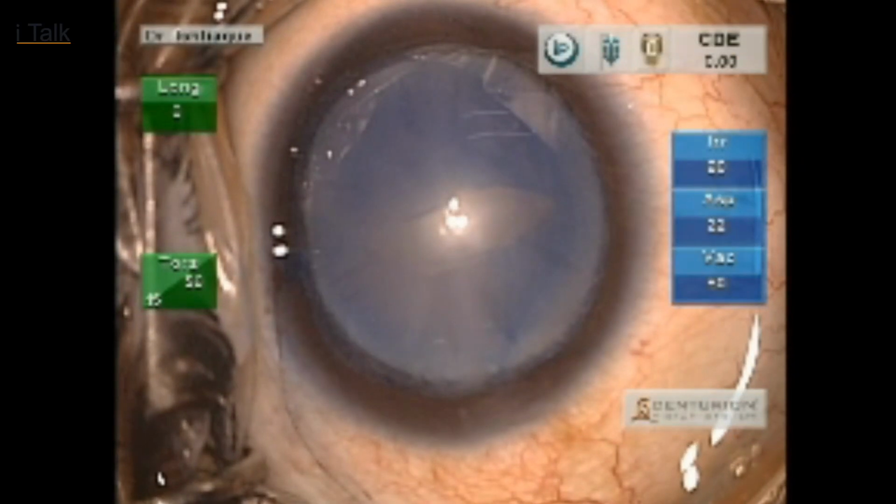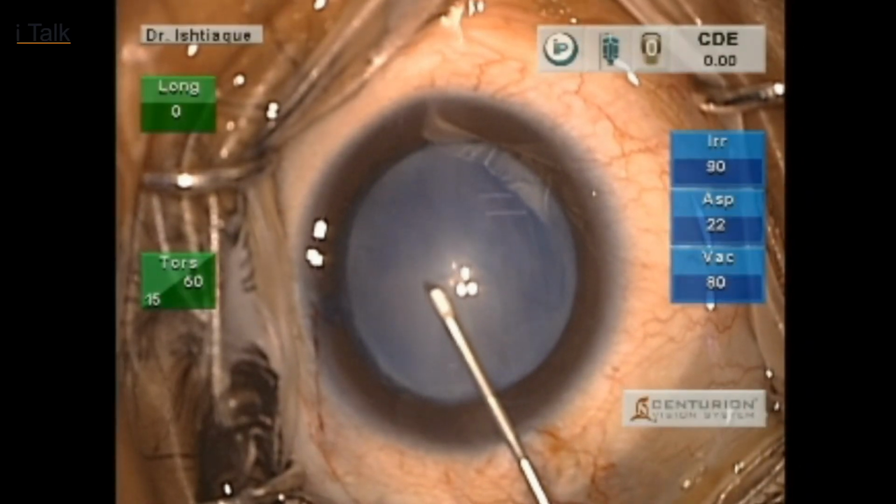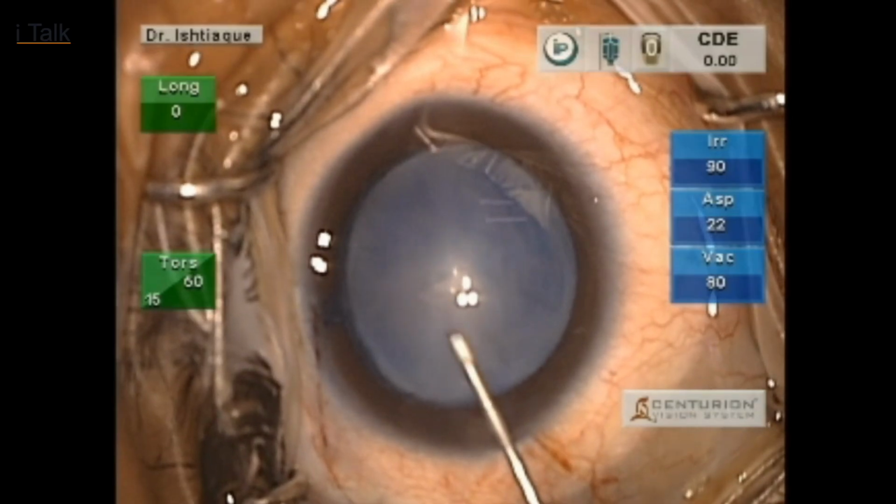This Argentinian flag sign is something which all of us make efforts to prevent. And there are a few things which, when you look back, you would have realized could have been altered. When you retrospect, you would have felt that it could have been avoided.